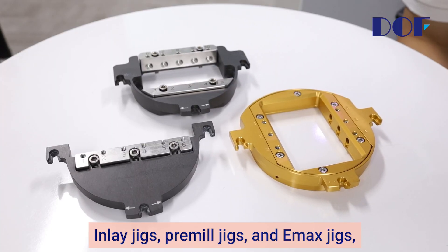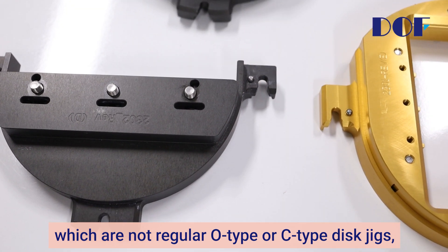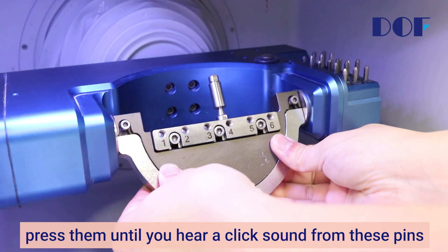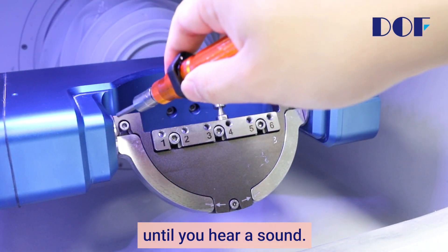Inlay jigs, pre-mill jigs, and Emax jigs, which are not regular O-type or C-type disc jigs, all have pins on the back. When mounting these jigs, press them until you hear a click sound from these pins and feel it being joined. Then, turn the holder bolt with a torque driver until you hear a sound.